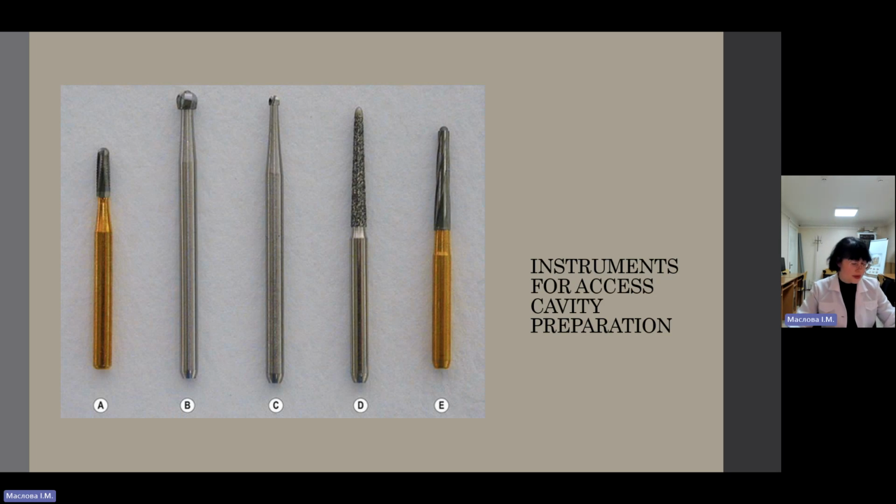In summary, the aim of root canal preparation is to debride the pulp space, rendering it as bacteria-free as possible, producing a shape amenable to irrigation and obturation. This apparently simple task is complicated by the anatomy of the root canal system, which is complex and makes cleaning it in its entirety a clinical challenge.